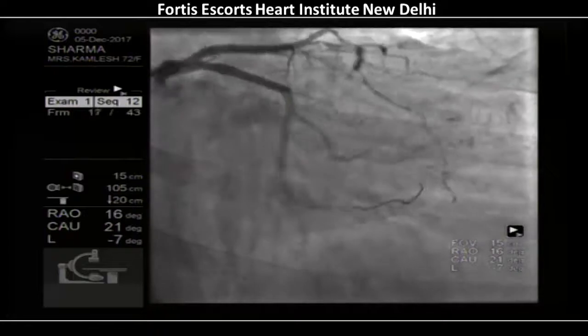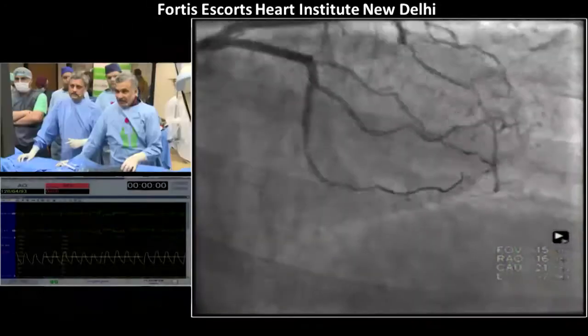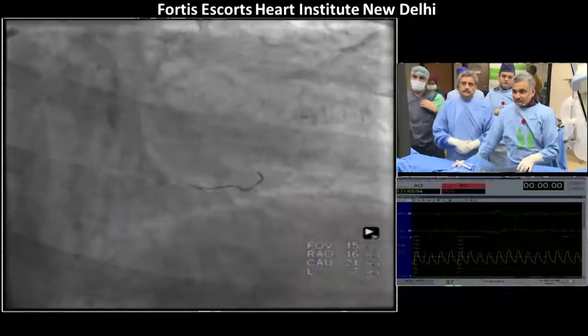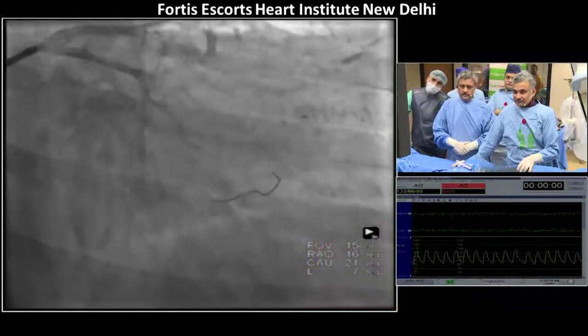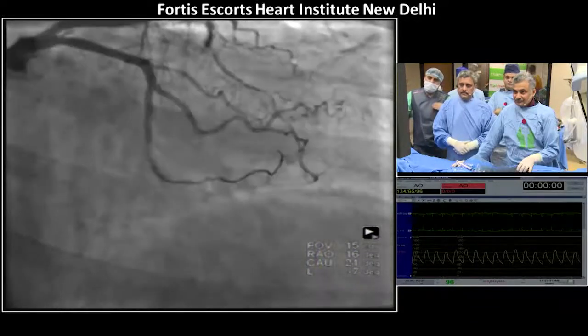Delty, what do you want to do here? I think, if I recall the last procedure which I did about a week back, what it was suggesting distally is dilating this distal part of the lesion. Yeah, we want you to expand the other stent and put in a short 2.5 stent, and make sure you image it and don't leave an outflow dissection.